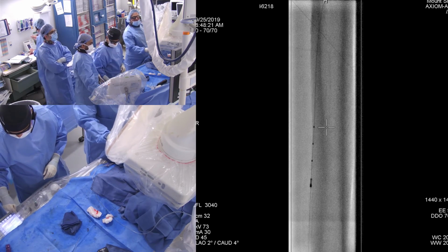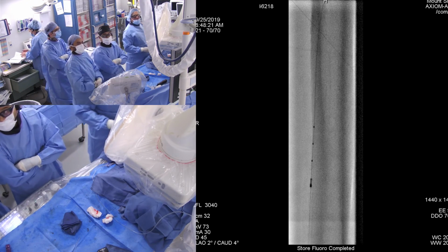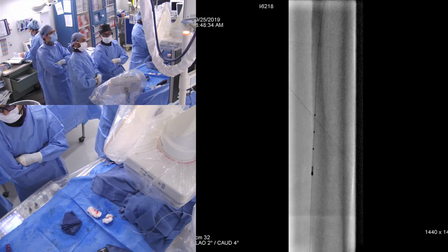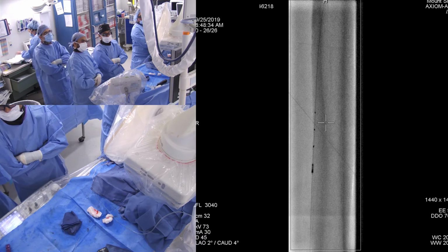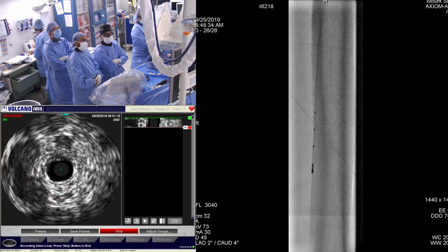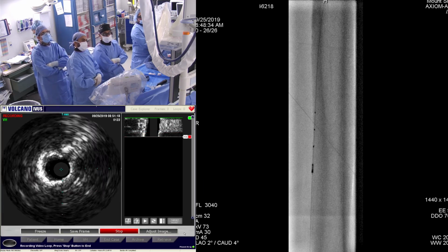Okay, IVUS, please go on IVUS for Dr. Rao so he can see it too. Let's go live. You're live? Okay, I'm going to pull back here, Ajit. So there's an IVUS from below. And Ajit, you can see the severe calcium, huh? Okay, yeah, I see it now.